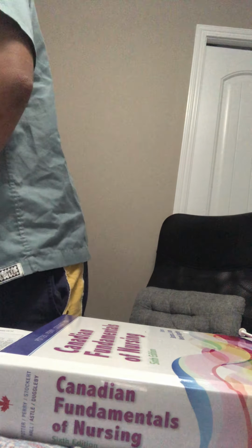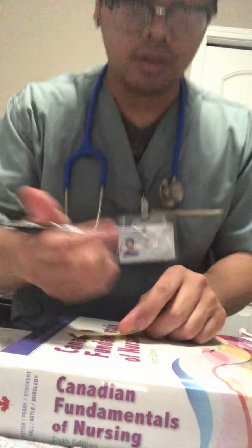Now that I've got everything that I need before I go to my patient room, I'll be doing a third check. Before that, I'm going to label my syringe first with my name, concentration, and the name of the drug. So we have heparin, 10,000 units, 1 ml, my name, and the time and date of being administered. Now I'll be doing my third check between my label, my MAR, and my drug.